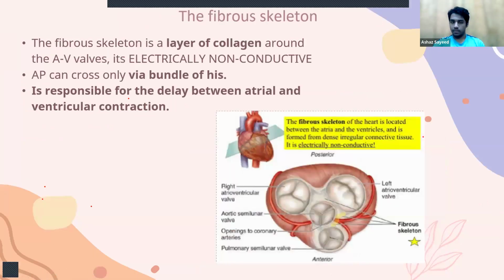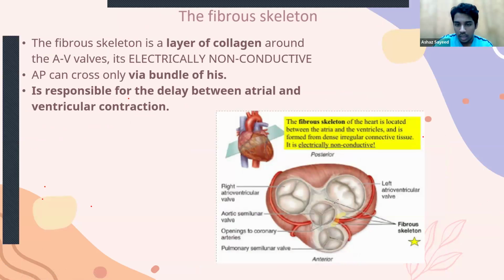The fibrous skeleton. Yeah, this is the image. These are the four valves. You can see this thing right here, which is in between the valves. That's the fibrous skeleton.